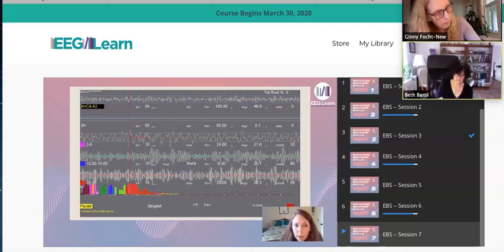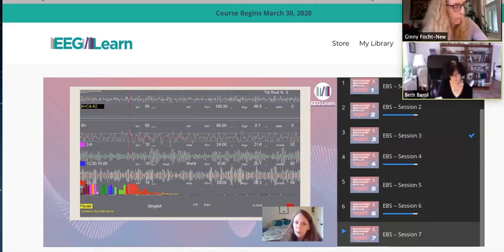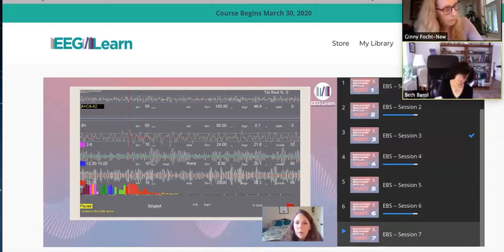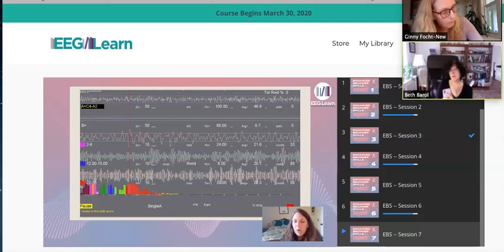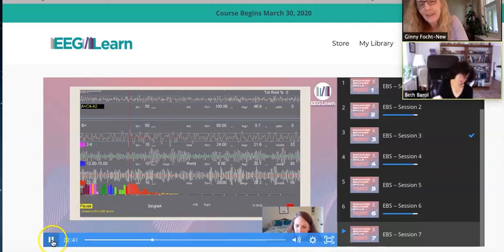The things that make the slow wave amplitude go up are getting sleepy, daydreamy, losing focus, visualizing something in your head other than what's happening right now. Those are what makes the slow wave go up. Okay. So, I'm slow wave.